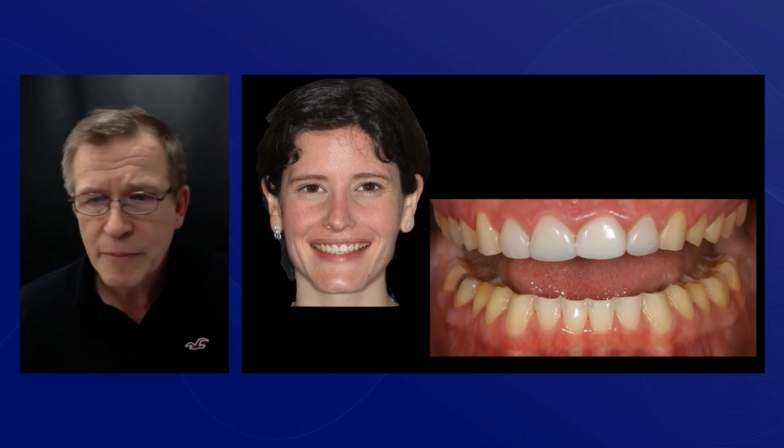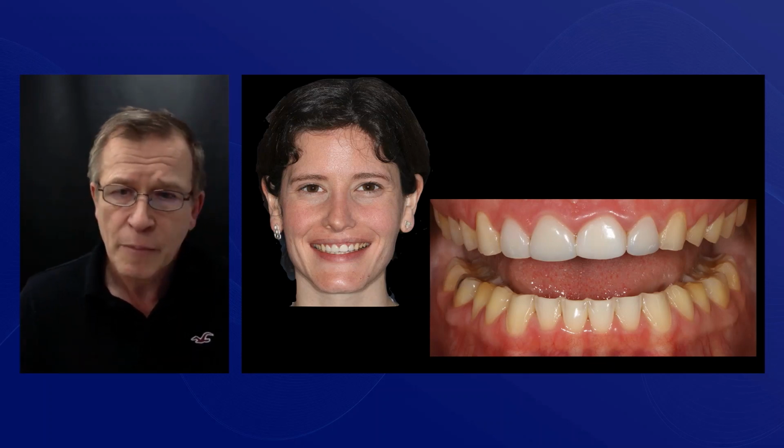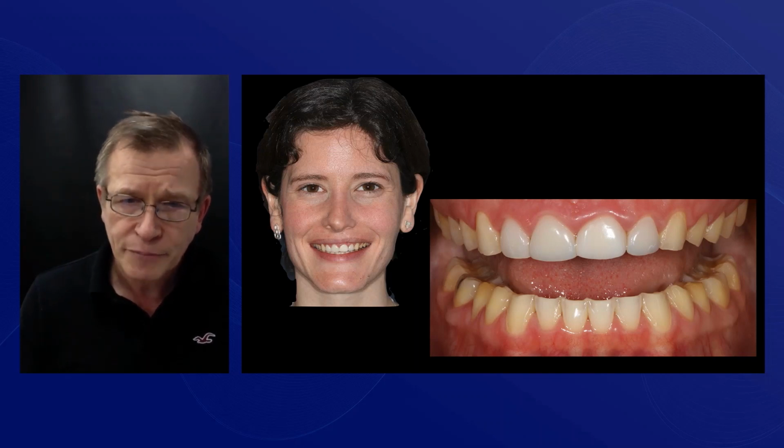So we look at someone like Meredith, and she'd suffered from bulimia. She had these worn teeth, eroded teeth. She wanted a beautiful smile. She had some problems with her joint. She wanted to stabilize the bite. I'm sure you can imagine it's a pretty long story in itself, which we're going to have a real short journey through at this stage. But she wanted us to make this as beautiful as we can and make it as stable as possible.